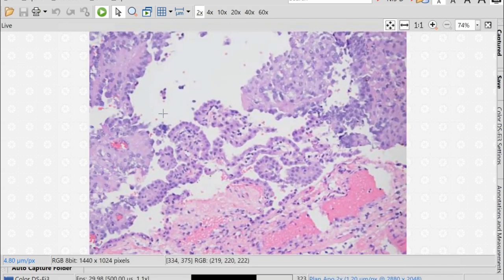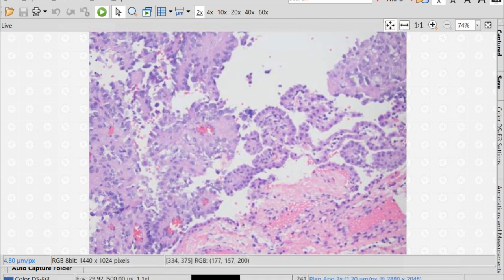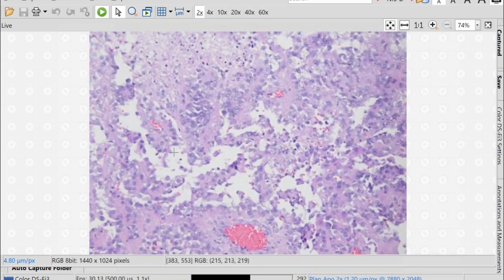This case is actually very telling and useful because you're seeing here entrapped normal, or non-neoplastic, choroid plexus for comparison. The non-neoplastic choroid plexus has this more cuboidal pink appearance compared to papillomas that start seeing more columnar epithelium, and then you have overtly atypical papillary architecture that goes more with a carcinoma.